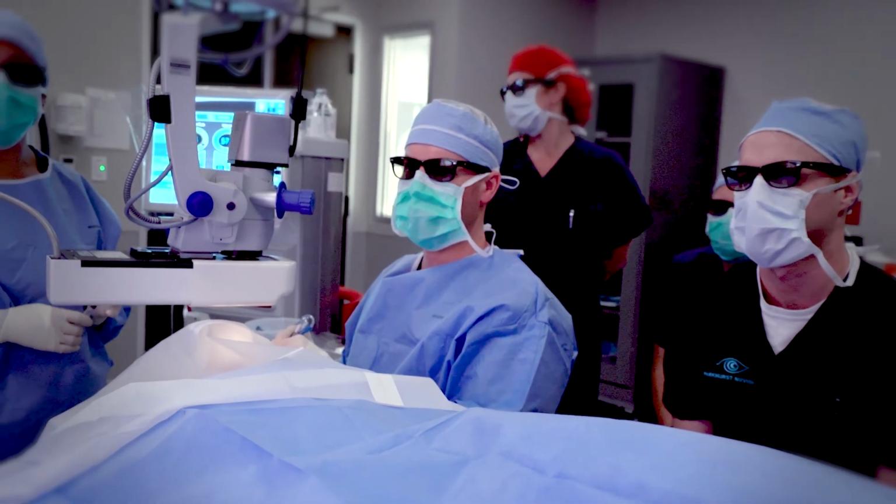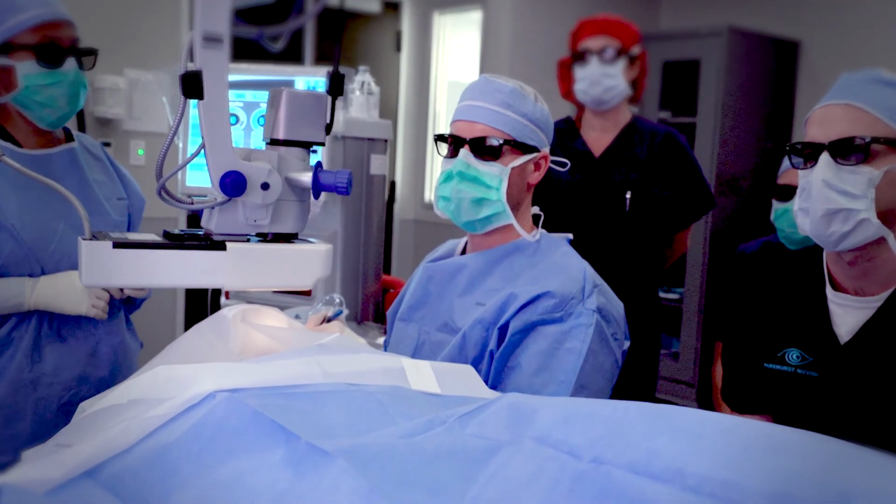I'm a big Aura fan. I like it for getting my power of not only the sphere but also the cylinder. I used to then do a second Aura scan for toric alignment. So I'd pick my power, put it in, rescan, tweak it this way, tweak it that way until we got that little NRR, no rotation required.